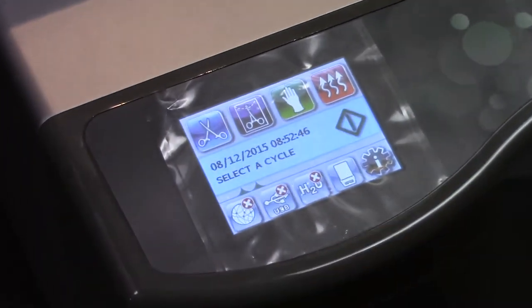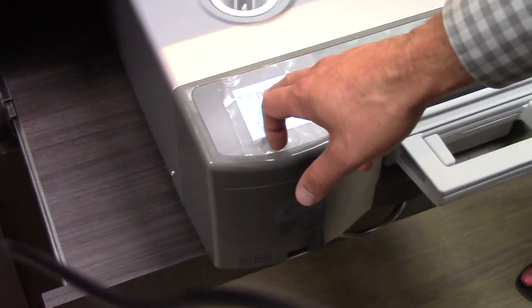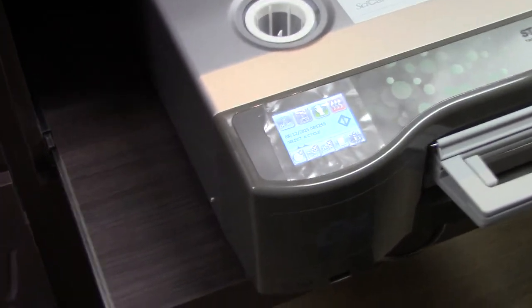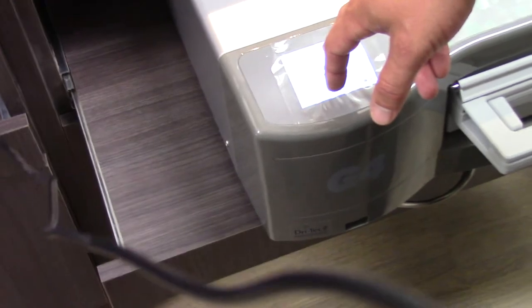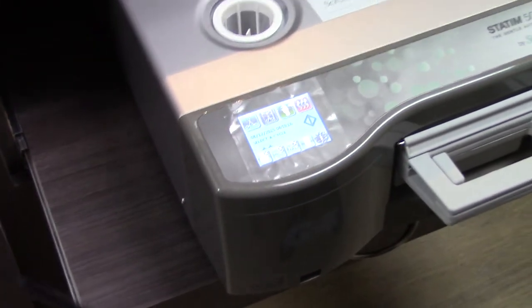Okay, so this is the Optimus for the quickest cycle for the hand pieces and stuff. Exactly, okay. And then this is the solid wrapped, same thing as the first one and two on there. So how long will the unwrapped take? The unwrapped on the 5000 is 9 minutes, and it's 14 minutes for the wrapped. Okay. The bigger one's a little bit longer than the smaller one. It is. It's about 3 minutes. So on the smaller one, it's 6. Okay. And 11. Gotcha.